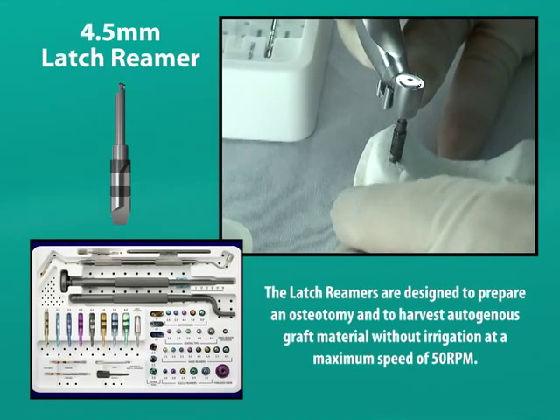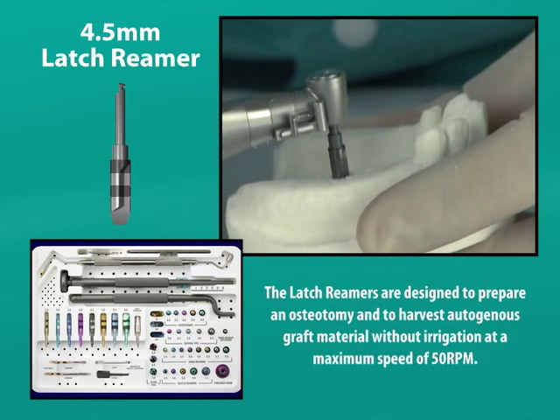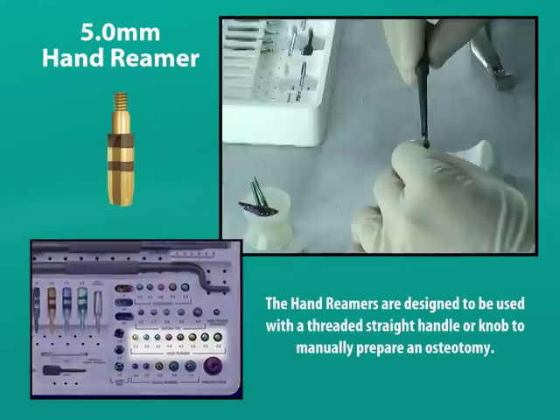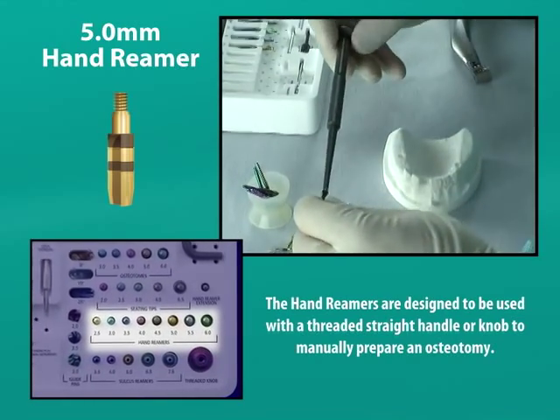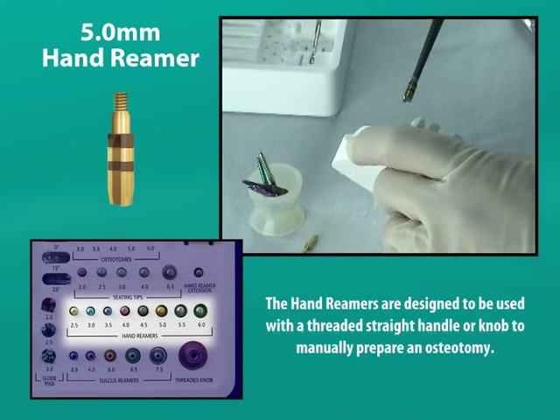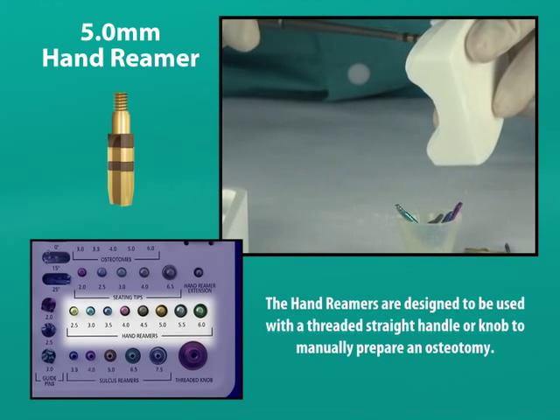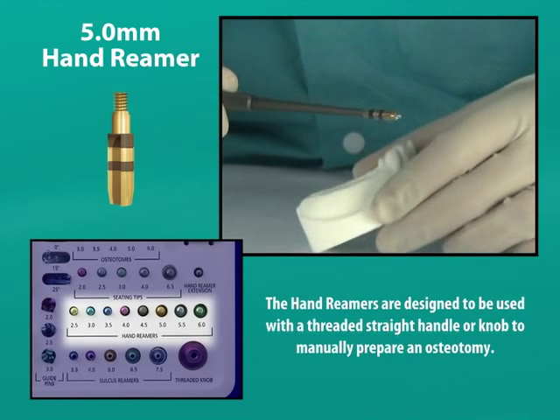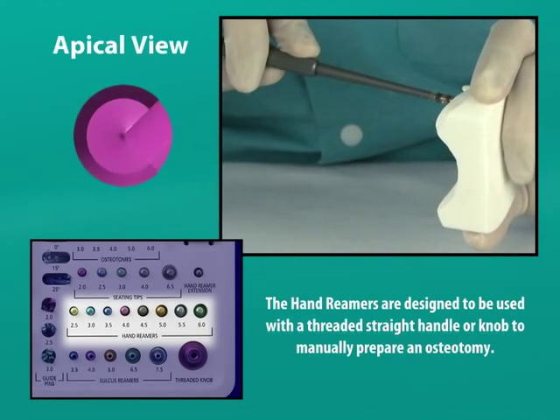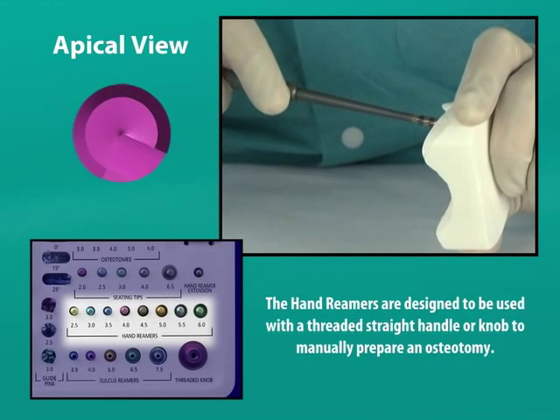It is important to reach the intended depth of an osteotomy with each reamer, or else the lower portion of the osteotomy will not be wide enough to properly seat the implant. We will now use our final reamer, the 5 millimeter hand reamer, as an alternative to the 5 millimeter latch reamer. They are designed to work with the threaded straight handle or the threaded knob. The hand reamers are similar in design to the latch reamers; however, they have only one cutting surface. They can be rotated only 180 degrees if desired, thus allowing for the cutting of only one side of the osteotomy while expanding the other side.